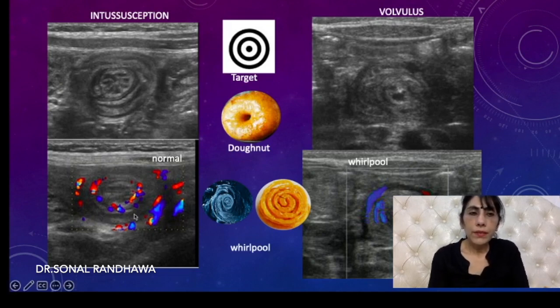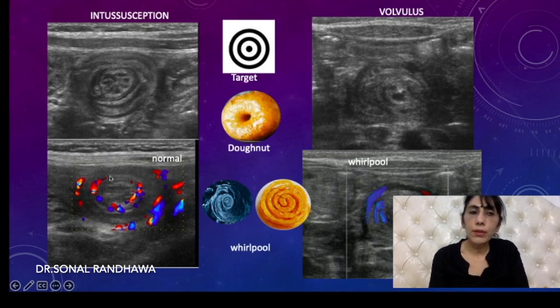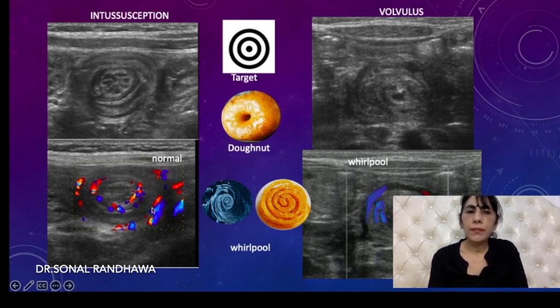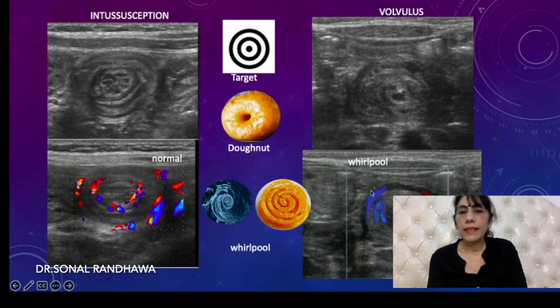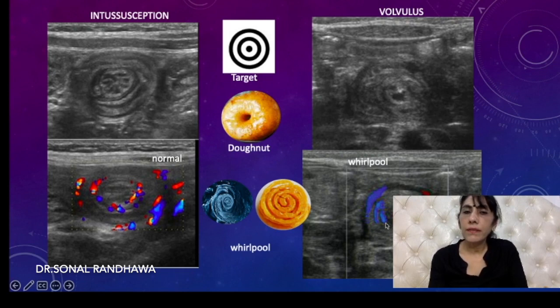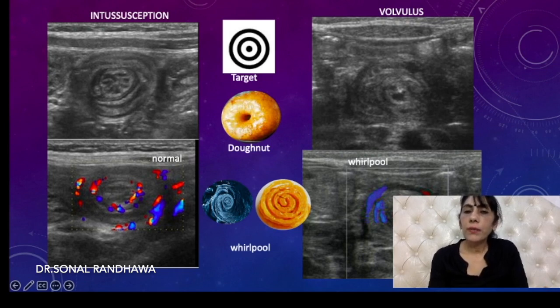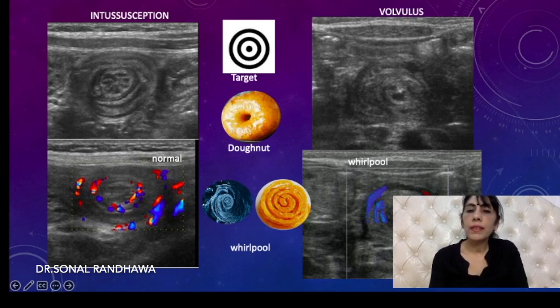On Doppler, in intussusception there is no twisting of the vessels, so the vessels look normal — similar to a normal bowel wall. But in volvulus, because twisting has occurred, the same whirlpooling happens for the vessels too. You will see incomplete or complete circles, with the central area being the artery and the vein and mesentery wrapping around it. This is called the whirlpool sign.